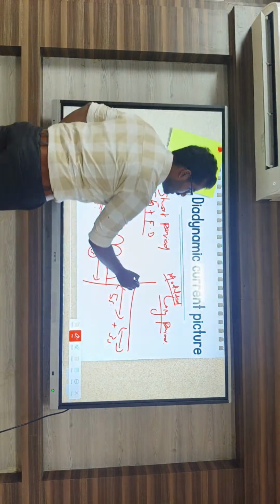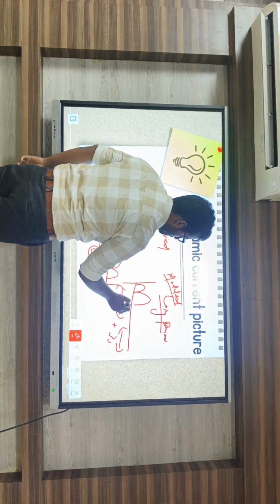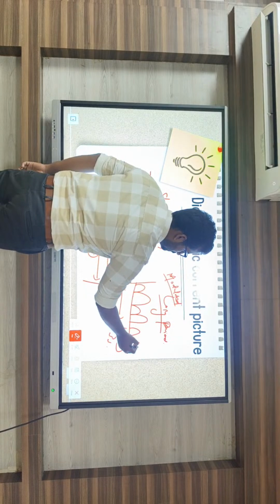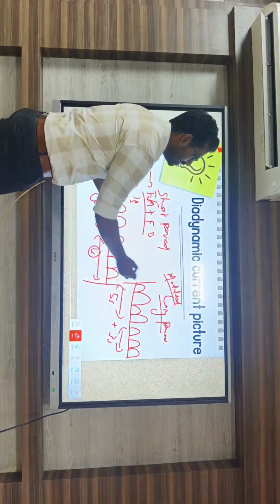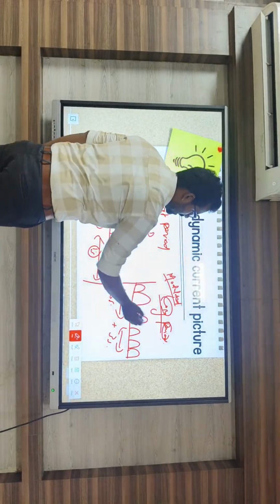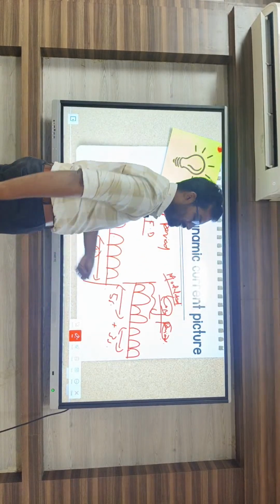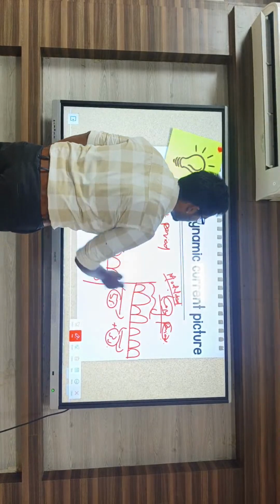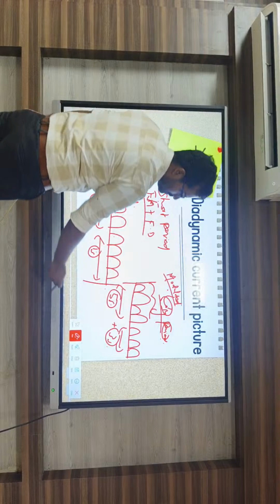So coming to the fixed diphase picture, plus fixed monophase, the durations get increased. That's why it is called the long period, that is 5 seconds and 3 seconds of the combination of fixed monophase and fixed diphase. Based on this duration, it comes under either long period or short period.